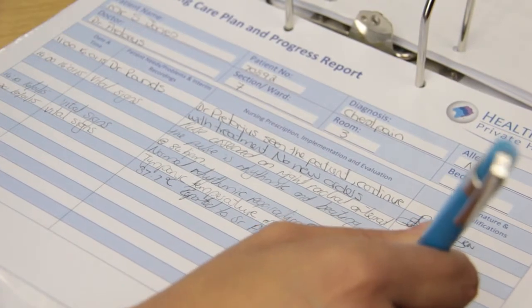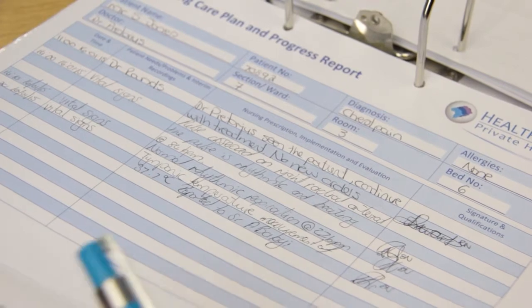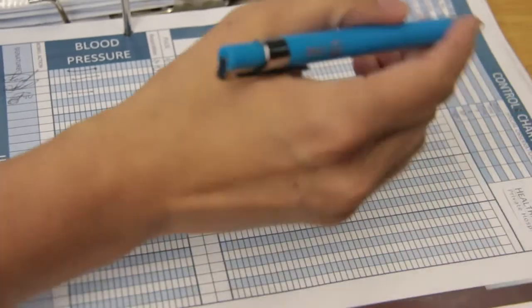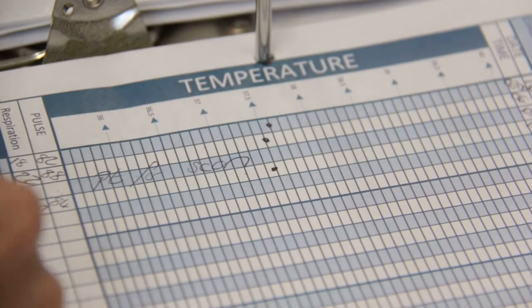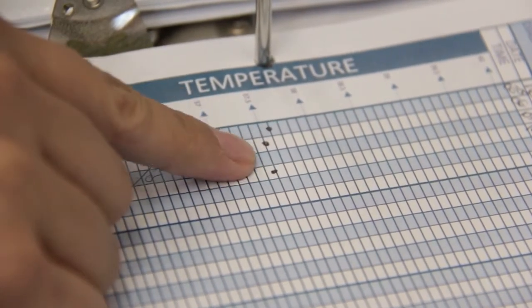Record keeping. If temperature reading is obtained from a site other than the oral route, document the site used along with the measurement. Record the temperature on the patient's vital signs record or control chart. Compare the reading with the previous readings and baseline data. Report any abnormal temperature readings to the registered nurse.